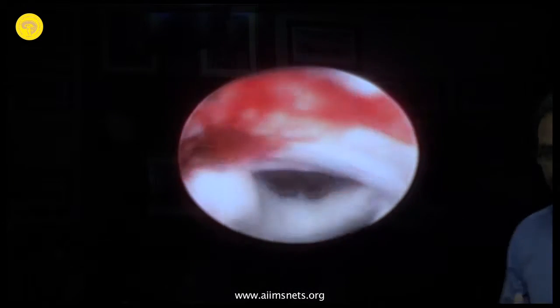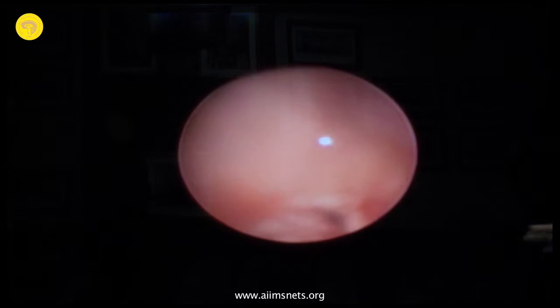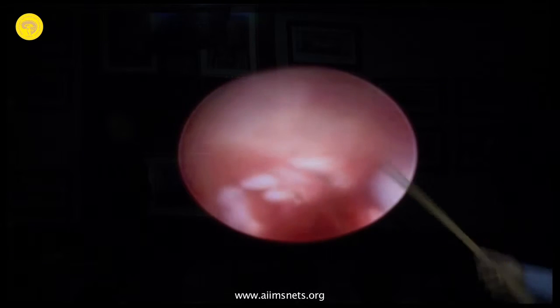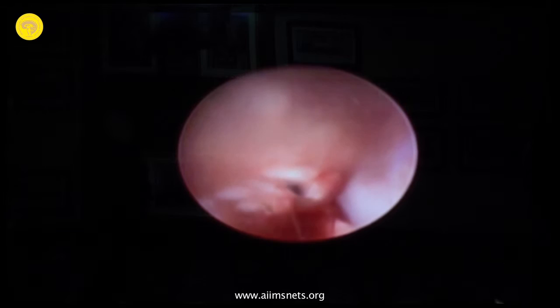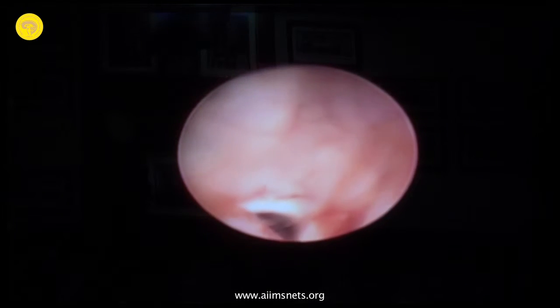So now I'll just take you to some situations. One is ventriculitis. Now, with repeated shunt infection, what do you actually see in the ventricle? Most of you would not have seen. It's completely hazy. This is what you see. This is the foramen of Monroe. There's no choroid plexus, no thalamostriate vein. This is the foramen of Monroe that you see, right? But there is no other option.